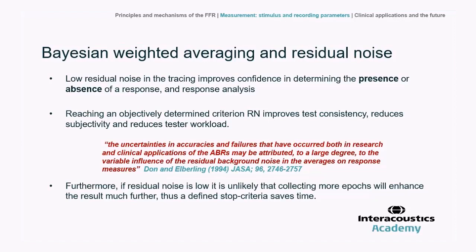And this is one of my favorite quotes from the ABR literature. I'm talking here in this case about transient ABRs, but of course the same concept applies to the frequency following response. So if measuring these responses in the way that I've tried to show, then please do consider the need to reach a criterion low residual noise level in order to resolve the response against the background residual noise.